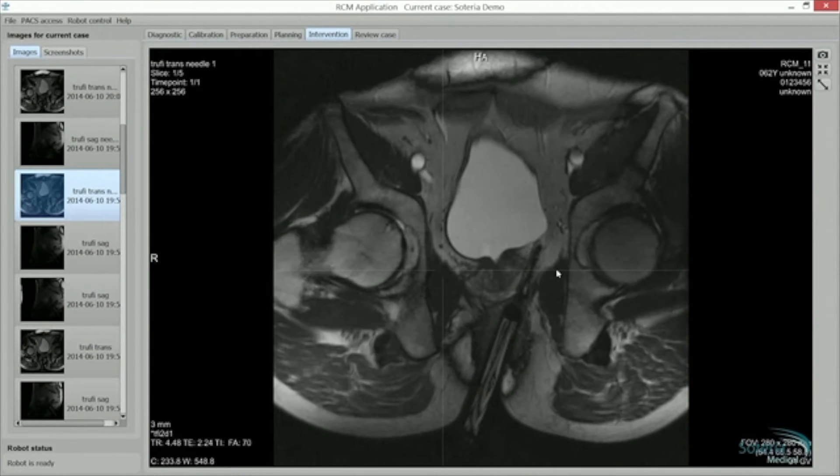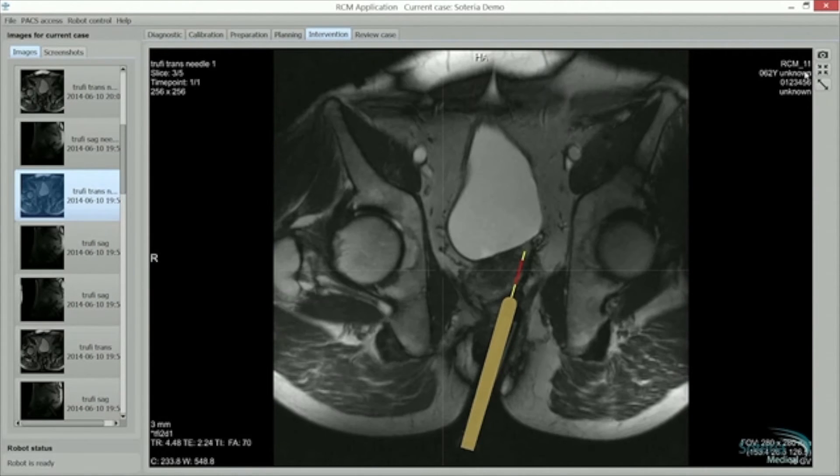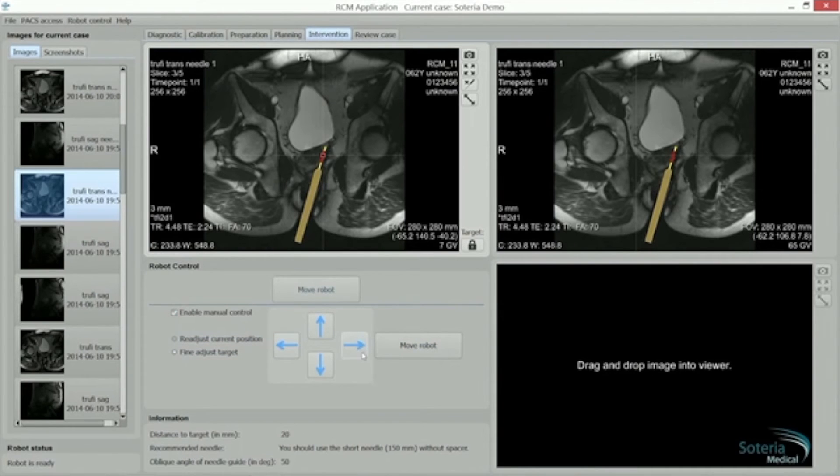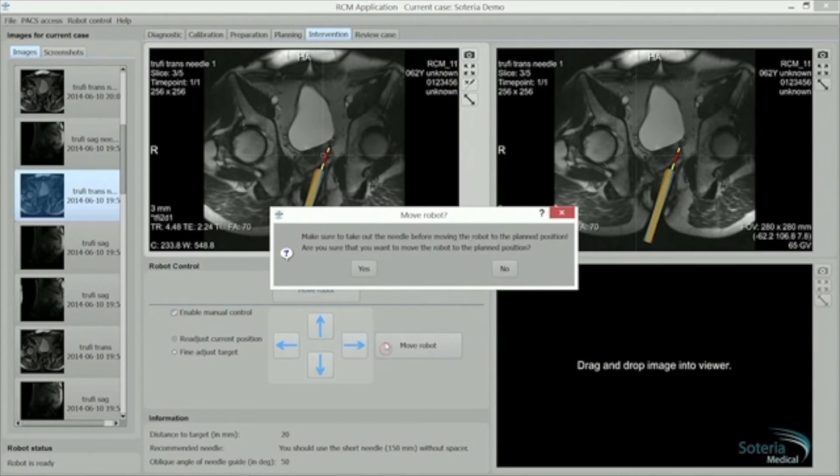Switch to full screen and the yellow shows the throw of the needle, the red the actual biopsy sample. Manual adjustment can be made in the top left working window. Accurate biopsies can then be taken in this position, in addition to the scan.